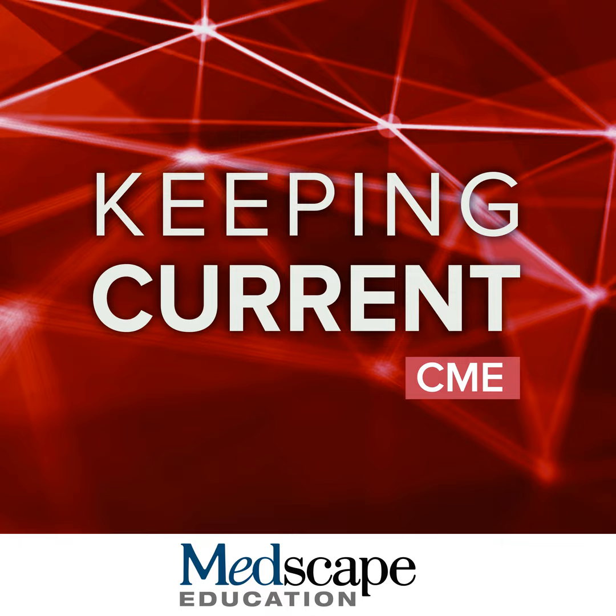All right. And so speaking of therapy, this is the big thing that has changed in the last 2 years. So in order to determine eligibility for therapy, an amyloid or tau PET is considered appropriate. Also, if you're monitoring patients on an amyloid therapy, a follow-up amyloid PET scan may also be appropriate.